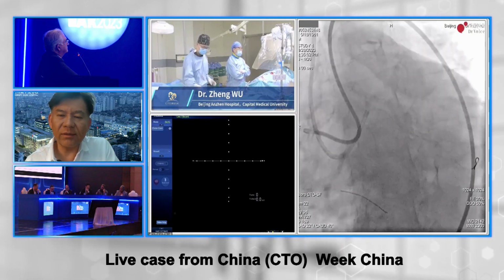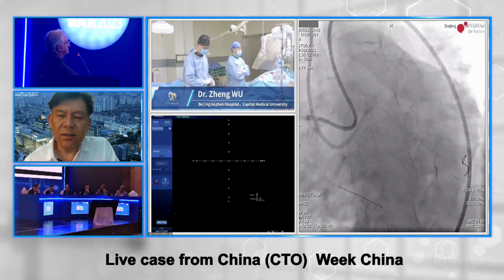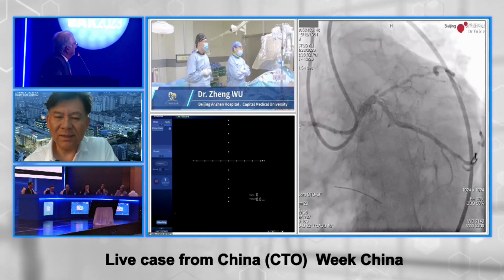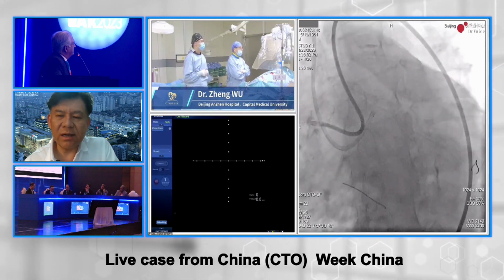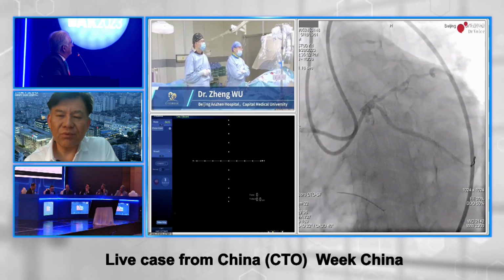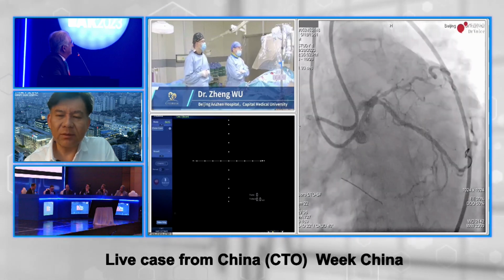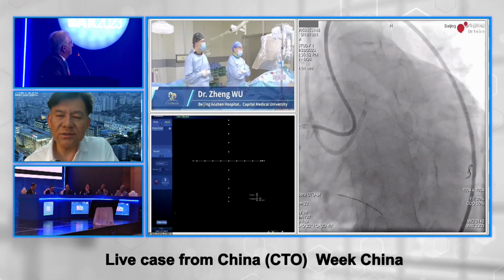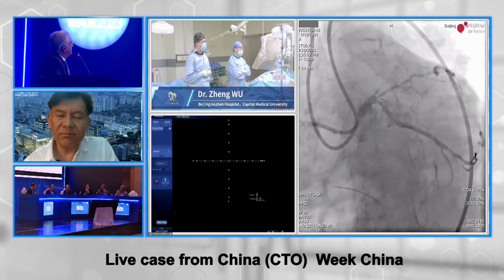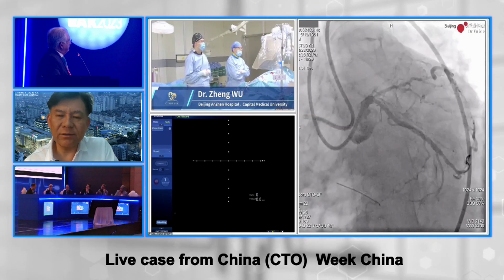So just to simply start, I want to comment on this because you have done multiple bilateral injections by the guiding catheter. It consumes a lot of contrast, so we are not stopping the procedure because of the radiation dose on the index procedure. So we have to minimize the contrast. In my case, I'm doing only one bilateral image, the most required image.